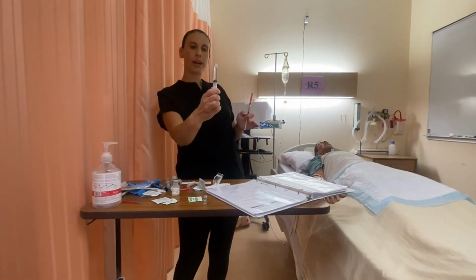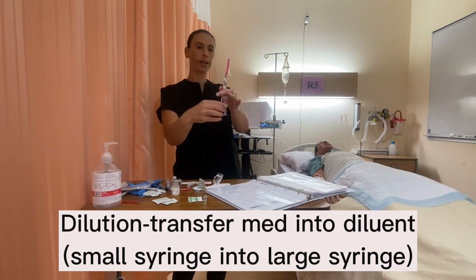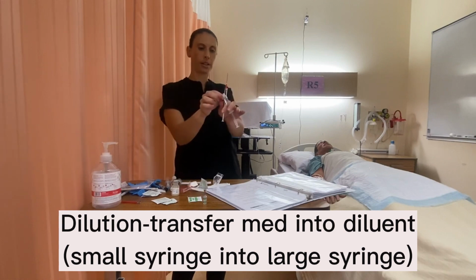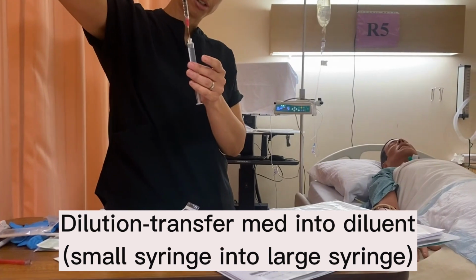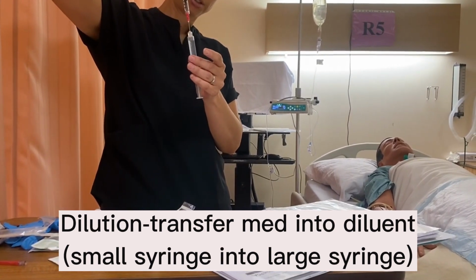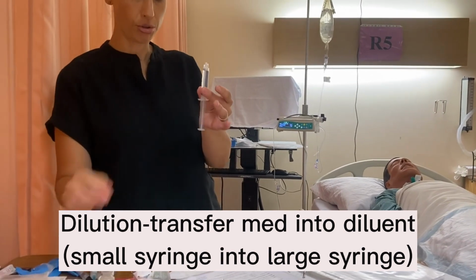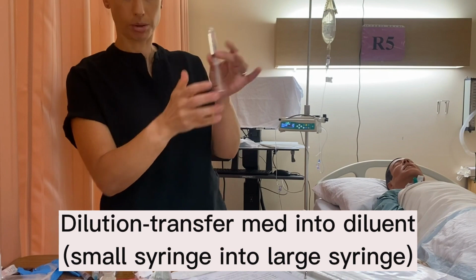And we're going to pull back our syringe and make a bit of an air window. So you can see there's an air window there. Okay. And now we're going to inject our morphine, our 5 milligrams, 0.5 mLs, right into our larger syringe. There we go, and we can prime that.